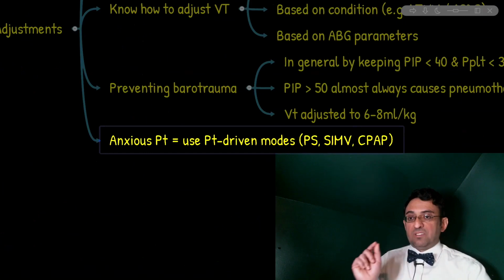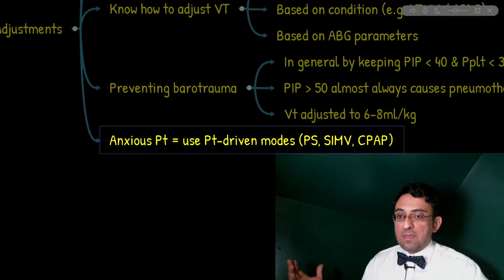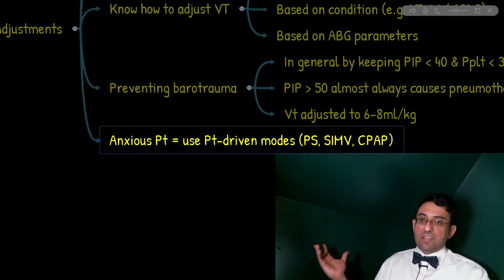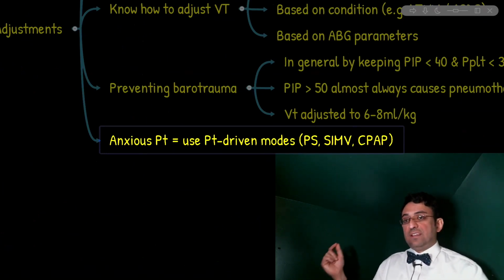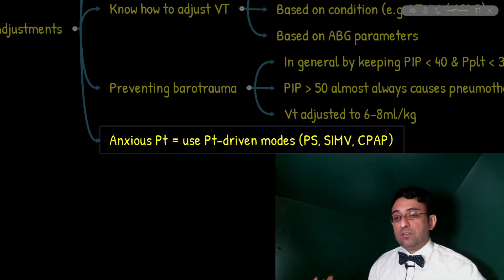What are the possible shortcomings or side effects of such an approach? For example, you have a mechanical ventilator setting with an I to E ratio of 2, and you are asked if this is a good strategy for a COPD exacerbation. The answer is absolutely not ideal for COPD, because in COPD we need CO2 elimination, therefore we need a prolonged expiratory phase.